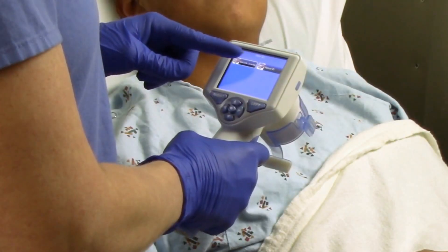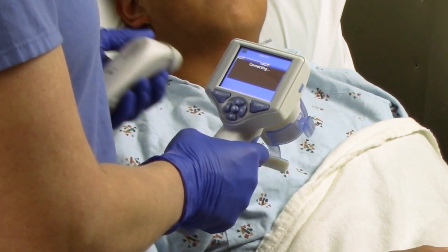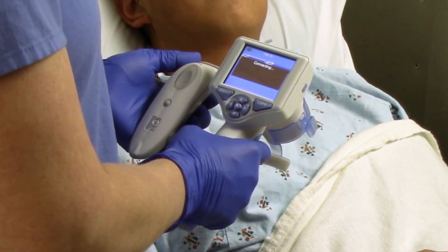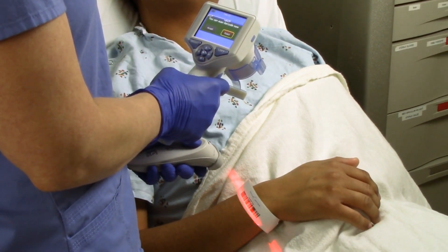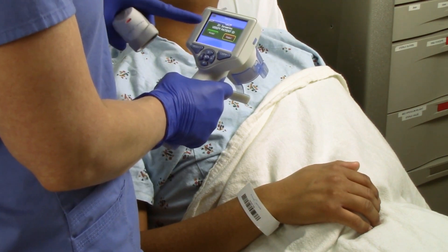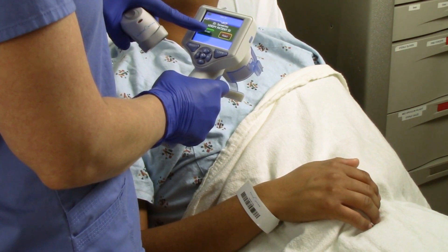On the NPI 200, select barcode scanner. Position the barcode scanner next to the NPI 200. The NPI 200 will display 'connecting' on the touch screen. Once successfully paired, the touch screen will prompt when the device is ready to scan the patient ID barcode. The patient ID will now appear on the NPI 200 touch screen. Confirm the patient information is correct and select Accept.